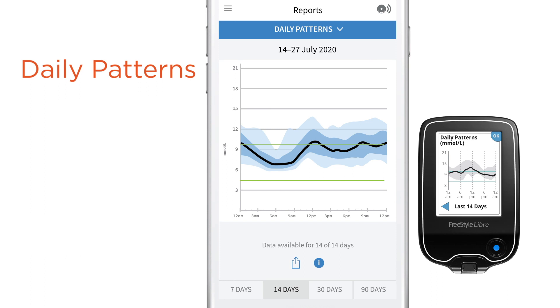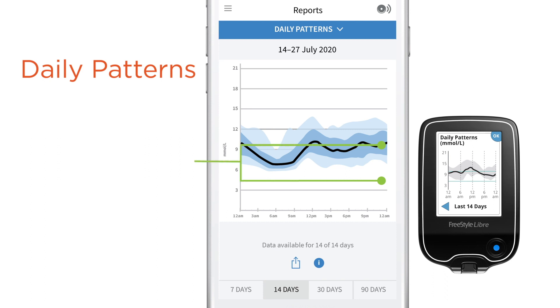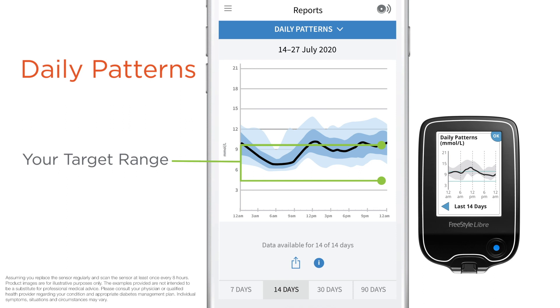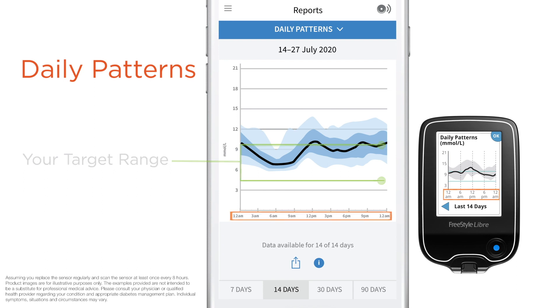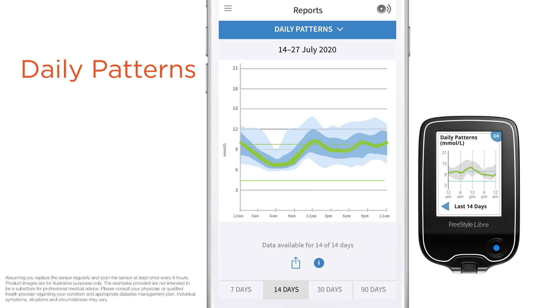You can choose how the information is summarized by selecting 7, 14, 30, or 90 days. I suggest you look at your last 14. The green horizontal band is your set glucose target range. Check to see if there are times of the day when your glucose results are below or above your target, and look at the times of the day this is happening. The thick black line shows the middle point of your glucose readings. It's also important to look at the curves on this line — when you're going up or down or above or below your target range, the flatter the better.